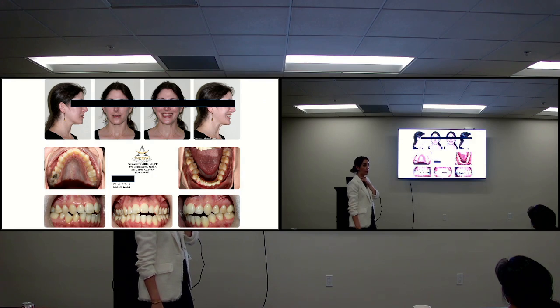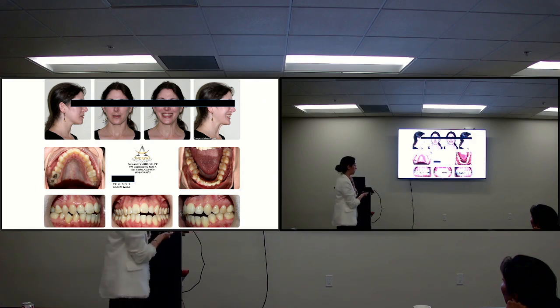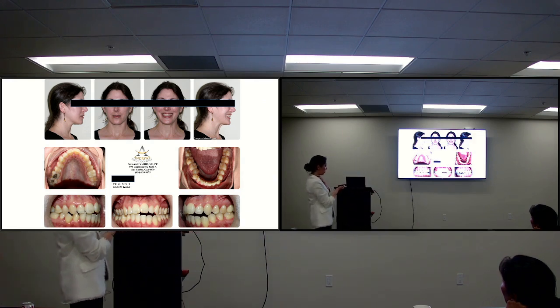So, that's terrible. And you could salvage that some. You could torque that root in, like we were talking about, but it's a disaster. So this is as hard as it gets, literally.